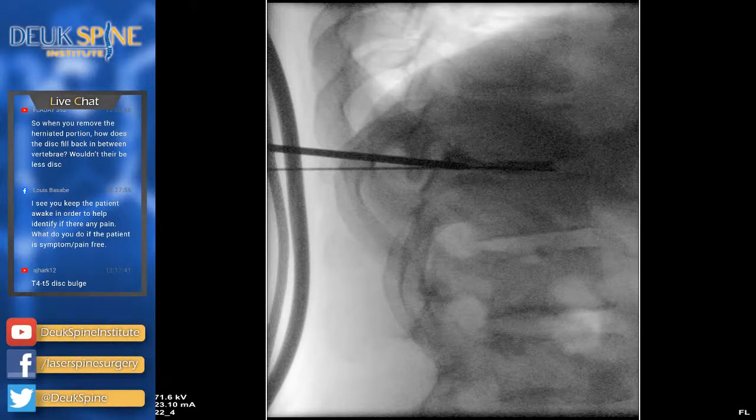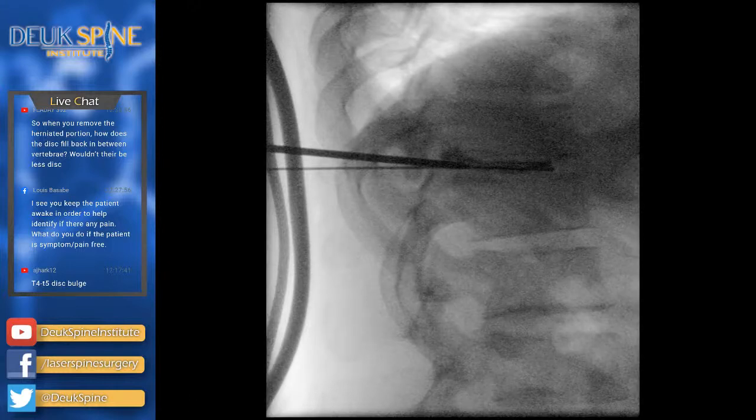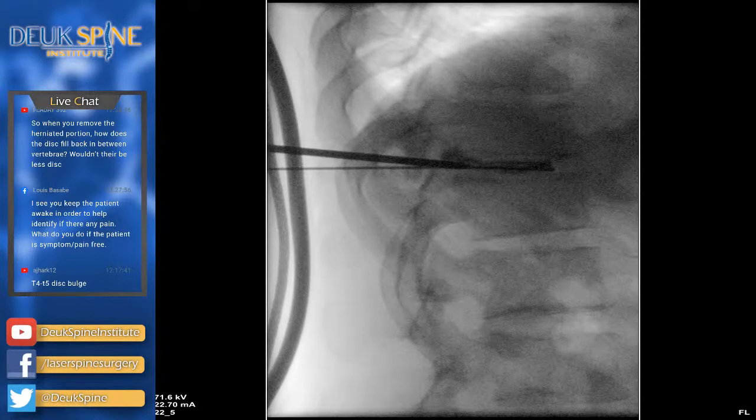So I'm in something called Kambin's triangle. Kambin, Parviz Kambin, was the first endoscopic spine surgeon in the world, out of Pittsburgh. He was a true genius and a pioneer. And we all build on some of his legacy, just like people will build on my legacy someday. Okay.